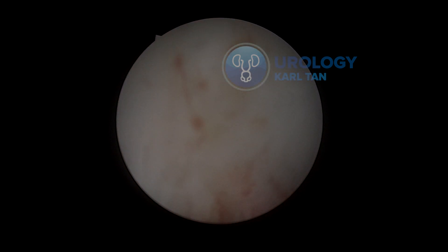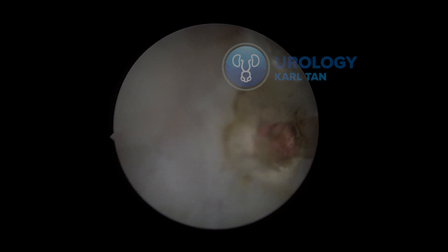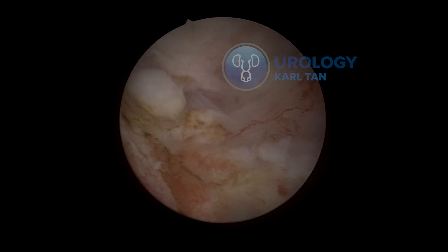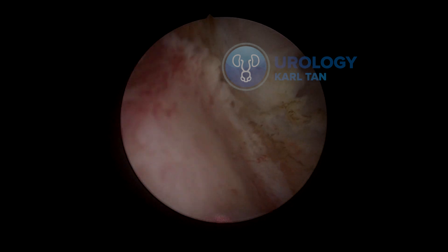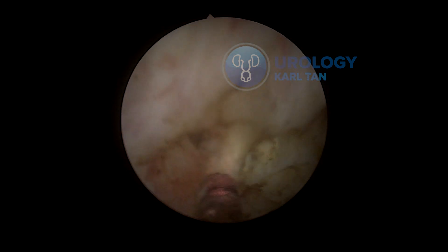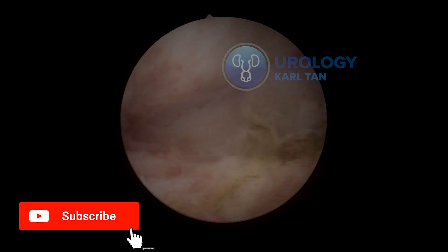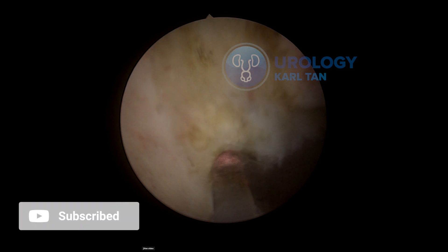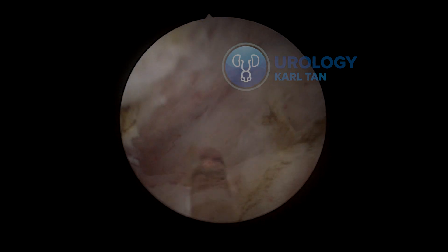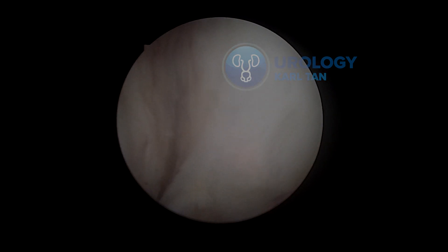After that, I try to release more from the right lateral lobe. If I'm able to release it, I continue on to the median lobe, releasing a little bit of the posterior and then finding the plane directly into the left lateral lobe. I do another blunt dissection to get into the right plane, then use the laser to cut through the prostate and release it from the anterior part and the mucosa of the urethral sphincter.